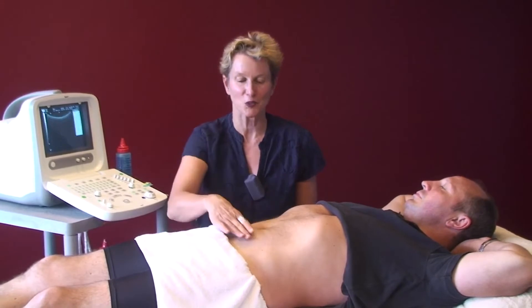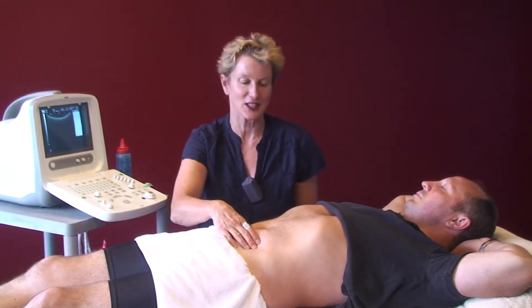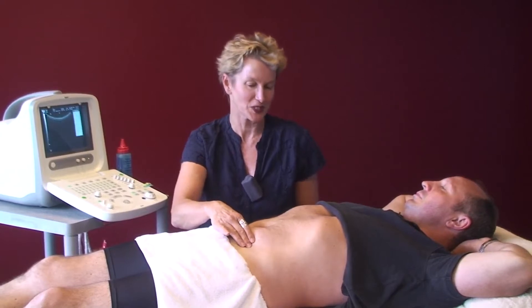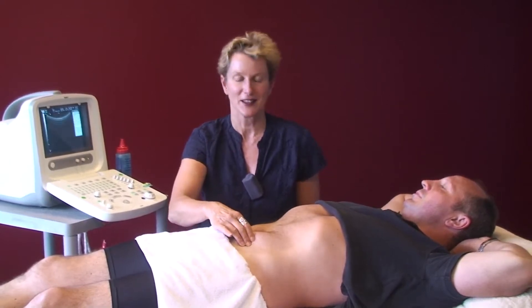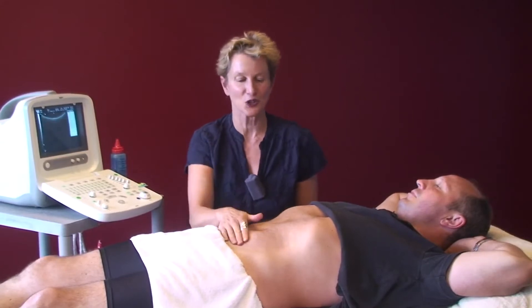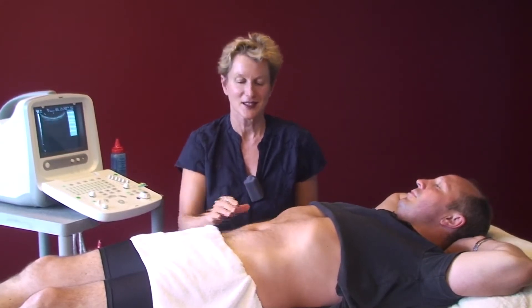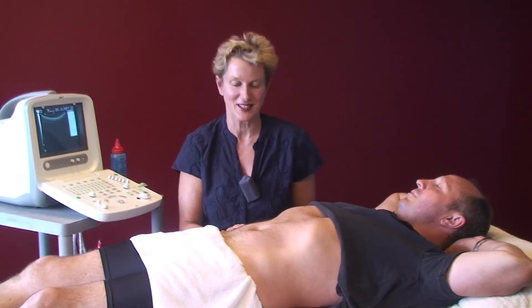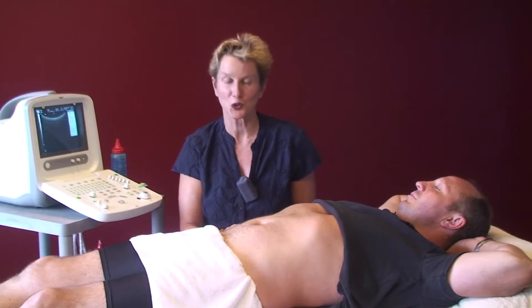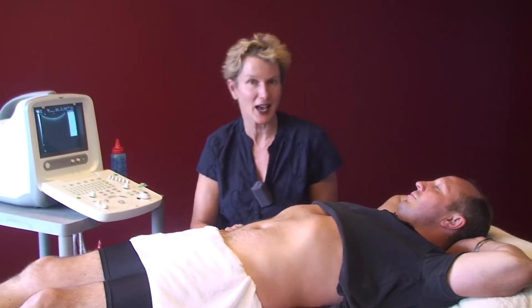What I'm watching there is what understanding they have. Now Alex is actually doing that quite well, but most people — show us what most people do — they suck right in. They're bracing with their external obliques, internal obliques and rectus. But Alex has got a good understanding of that. Now we'll look at the machine and see what's actually happening.